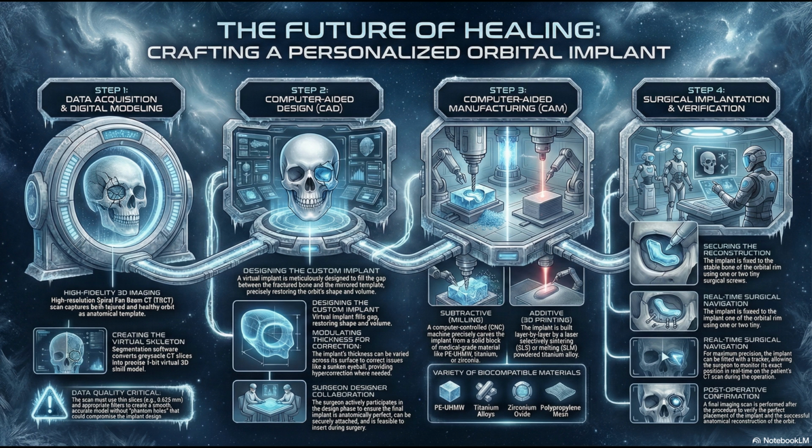So to get around this, the designer has to do this really aggressive and time-consuming manual edit. They have to go into the raw data and virtually paint in a solid wall by replacing the air in the sinus with a maximum brightness value, just to trick the software into seeing a boundary that was actually there all along. And I'll concede, dealing with those pseudo-defects is a huge headache.